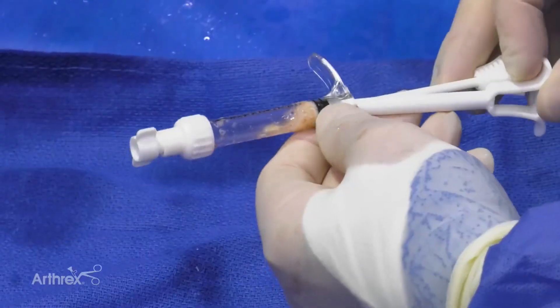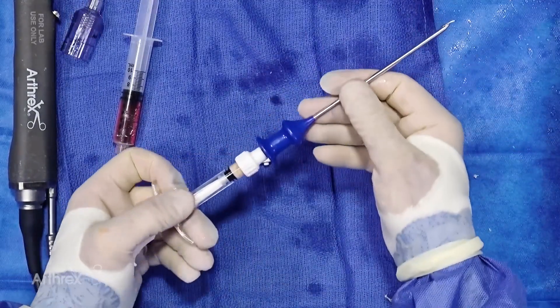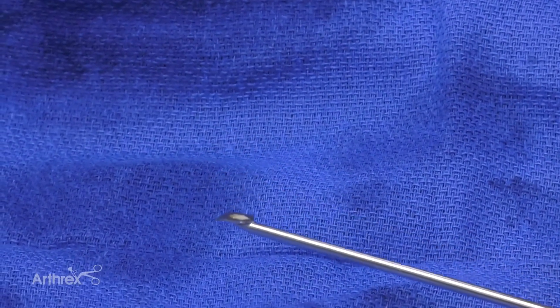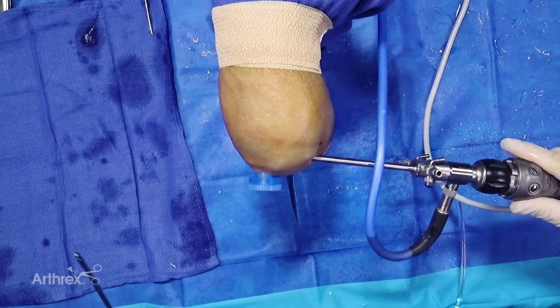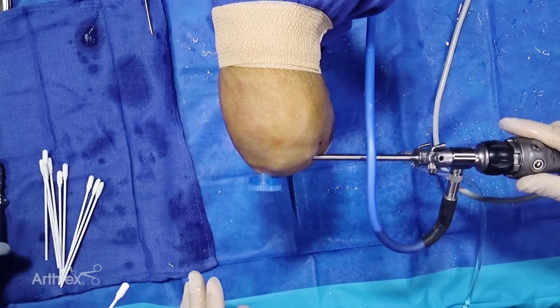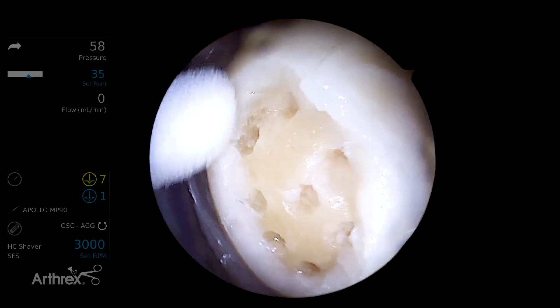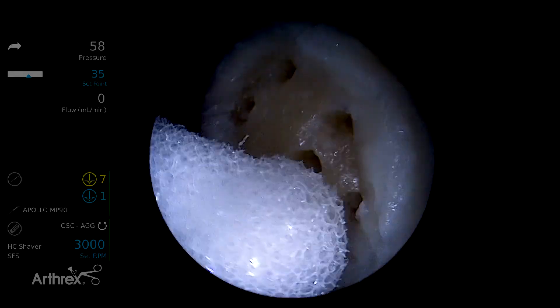Next, we'll assemble the syringe — now it functions like a traditional syringe rather than a mixing syringe. We're going to introduce it through the cannula and extrude it using a pusher, priming the cannula and using the plunger to deliver it to the end. We'll start by using the shaver to eliminate any excess fluid, then use suction swabs. A useful trick: when you get fluid on the scope, touch it to soft tissue and then return to visualize the area — this helps with dry arthroscopy. We'll go through the passport cannula to dry the defect, since we'll be using a fibrin-based biologic glue to seal the autologous graft.